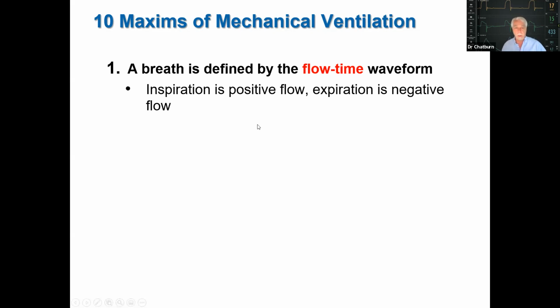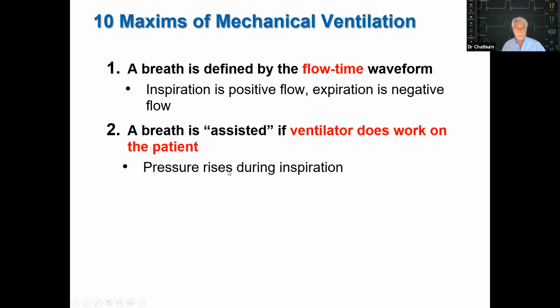The very first concept is that a ventilator is designed to deliver breaths to patients, right? So we have to define a breath, at least in terms of the way the ventilator thinks of it. It turns out that we define a breath in terms of the flow and time waveform. The convention is that inspiration is positive flow and expiration is negative flow. If there's an inspiratory hold, a period of no flow, we lump that in with inspiration. At least that's how most, if not all, ventilator manufacturers do it.